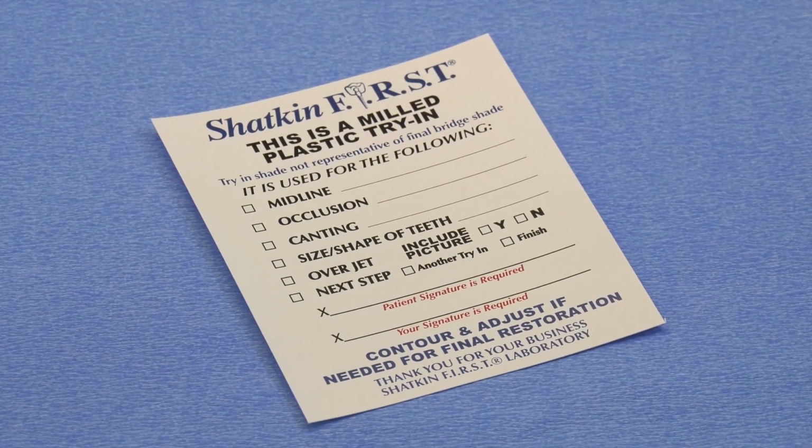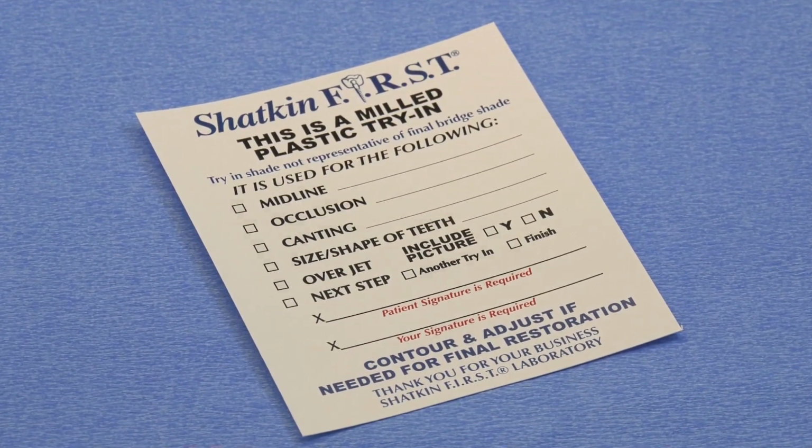Grind on them, adjust them, add composite to them, subtract from them, adjust the bite. If you need to move the midline, go ahead and grind on it, mark a new midline, and write any notes you need to our lab technicians so that they can make the corrections you want. When doing your try-in, make sure you refer to this slip and fill it out properly.